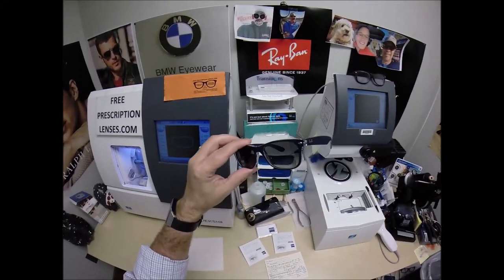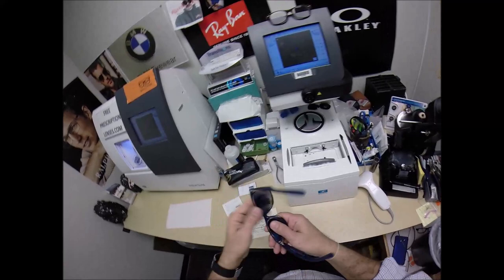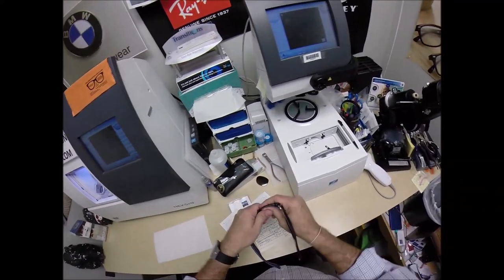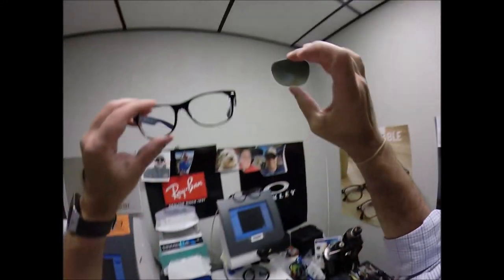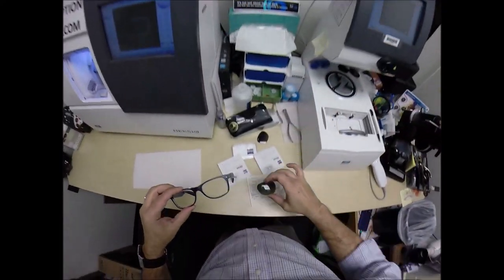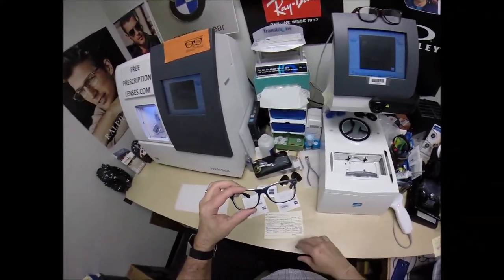Only the cool people wear these, and I'll tell you why in just a little while. I'm going to pop out your original demo lenses — your heavy glass lens. Listen to that. That is glass. These originally come with a gray gradient lens color.